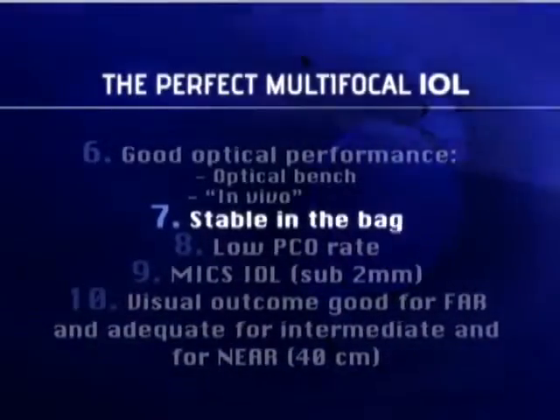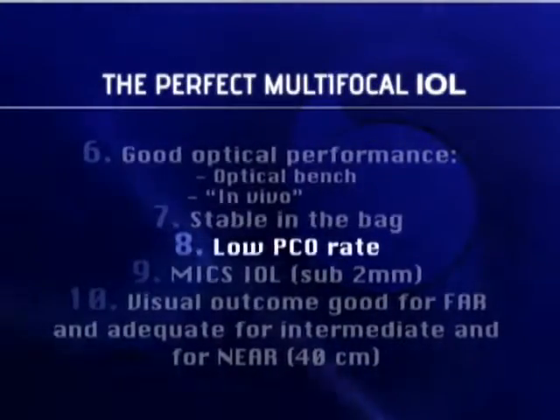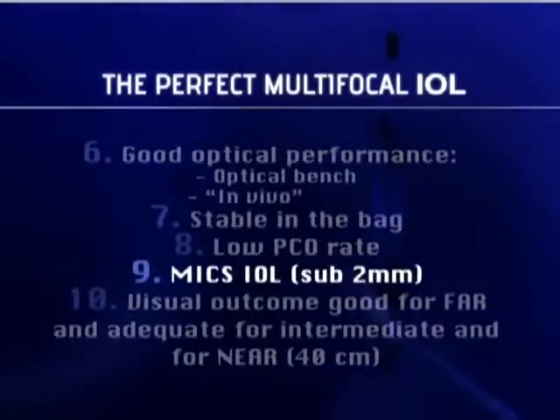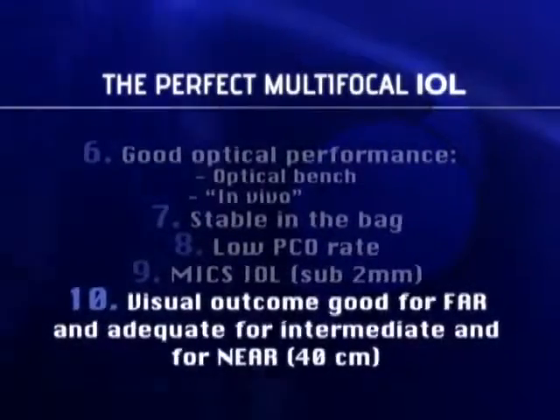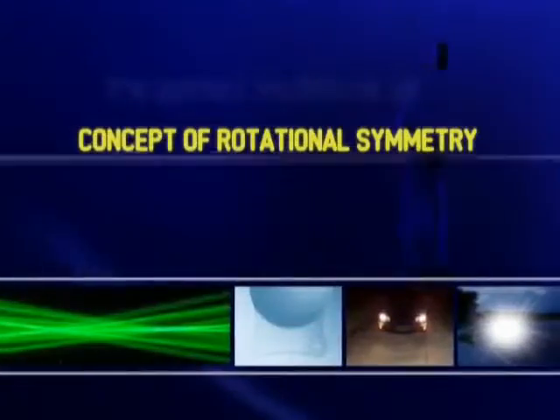It should also be stable in the capsular bag, inducing a very low PCO rate. Finally, it should be used sub 2 mm so as not to induce astigmatism, and it should provide good visual outcomes for far, intermediate and near.